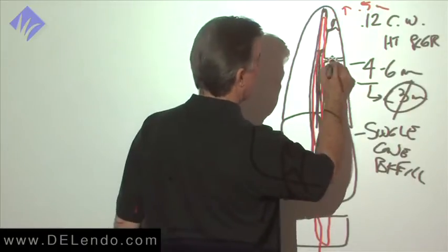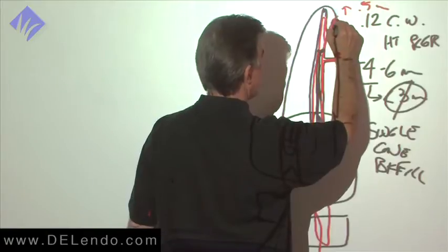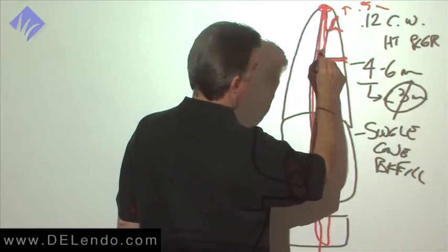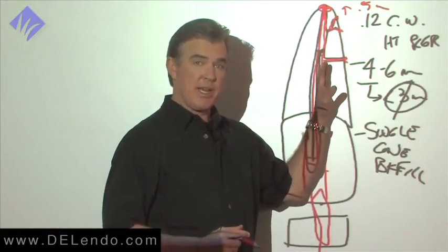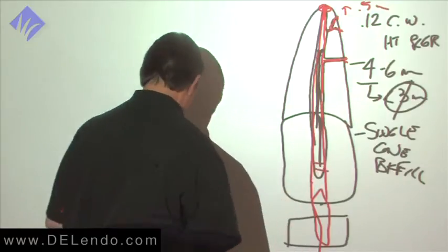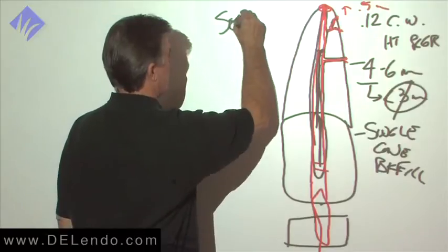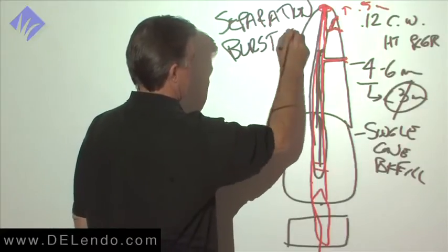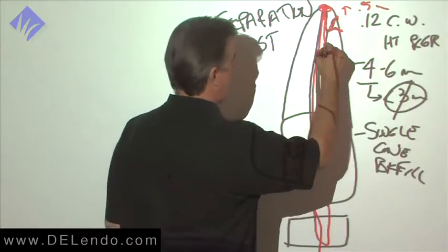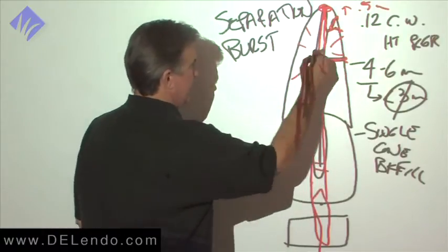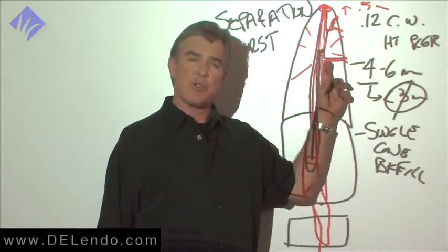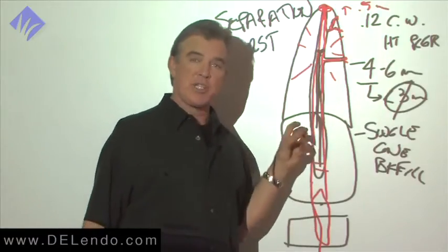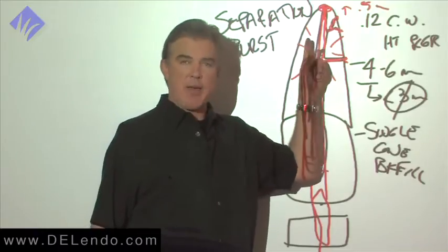At this point, all of the lateral canals are filled. We have cute little puffs here. Everything in the canal, primary canal, we might have a little puff there. And we have the plugger in place now. We have two options. We can do a separation burst of heat. What that is intended to do is to flare a heat pulse through there that heats the plugger tip and the gutta percha next to it so hot enough so that the gutta percha right here can't hold together. When we retrieve the plugger from the canal, the gutta percha will be glued onto it, and the apical mass will stay there.